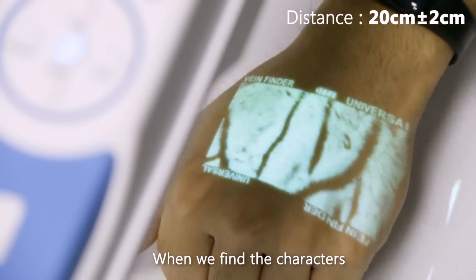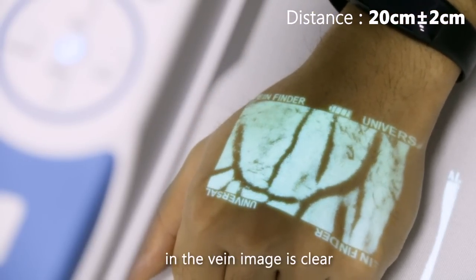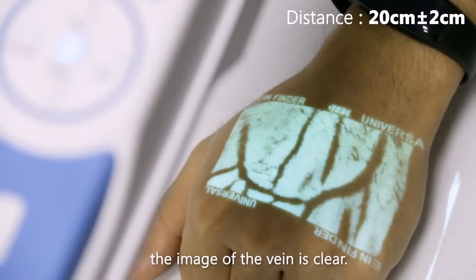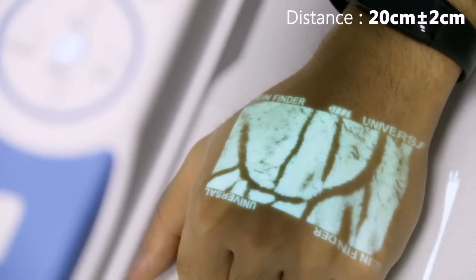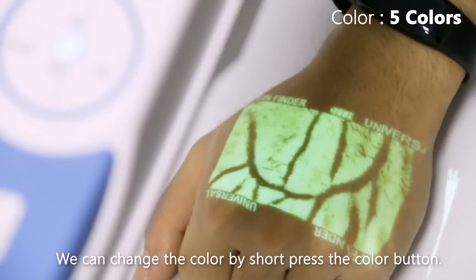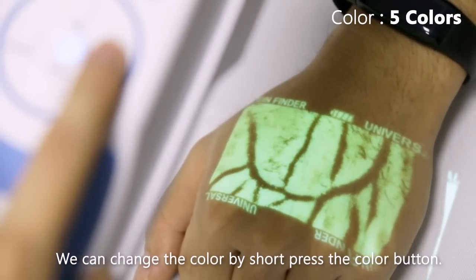When the characters in the vein image are clear and the vein image is clear, there are five colors available. You can change the color by short pressing the color button.